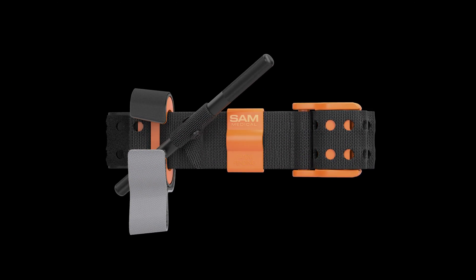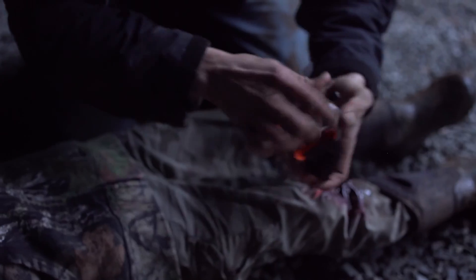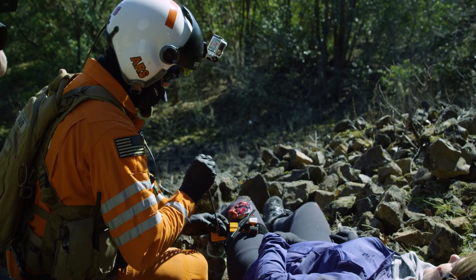This is the SAM XT Extremity Tourniquet by SAM Medical. Partner Aid — Upper Extremity.